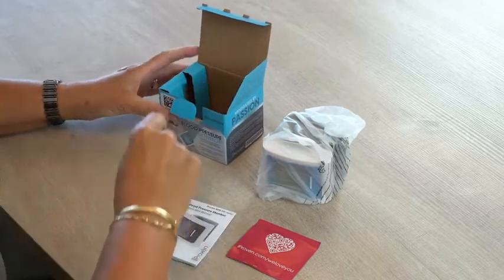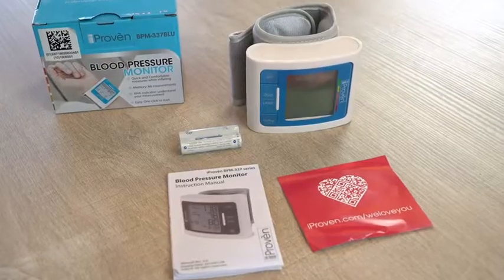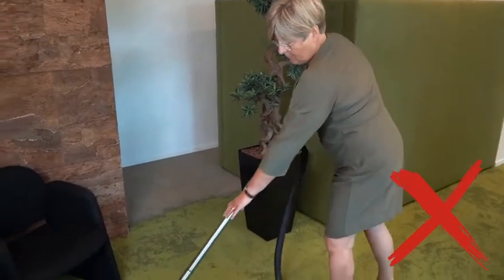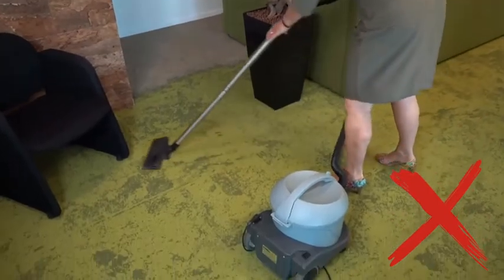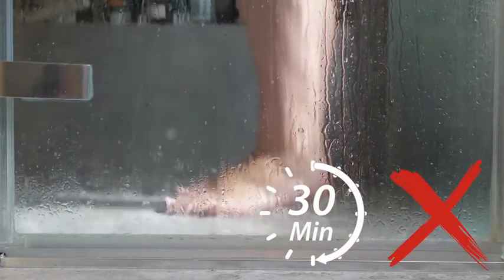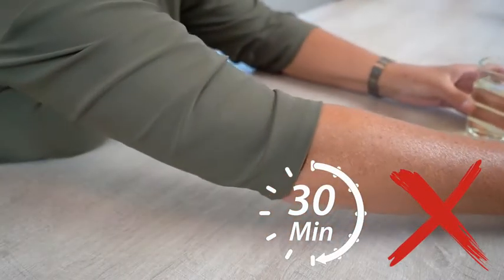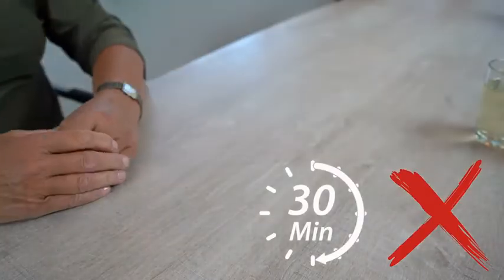The things you do before you start measuring can have a huge impact on the accuracy of your readings. Before you start measuring, try to avoid strenuous activities. Do not shower or bathe 30 minutes prior to measuring. Do not drink hot or very cold drinks 30 minutes before you start measuring. A few minutes before taking a measurement, sit still and try to relax while taking a deep breath.